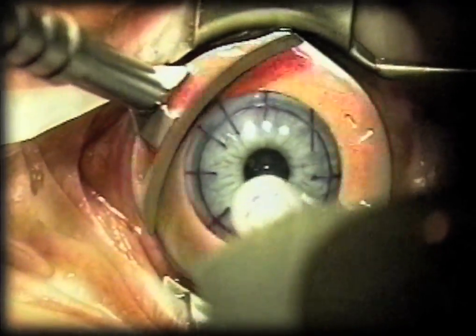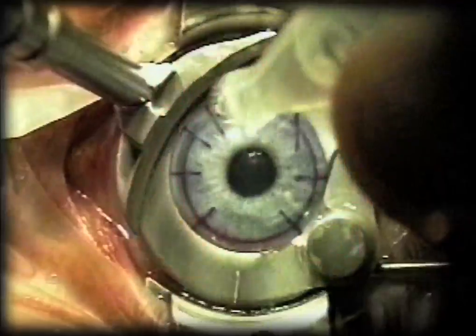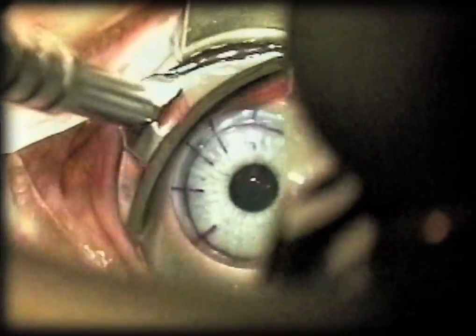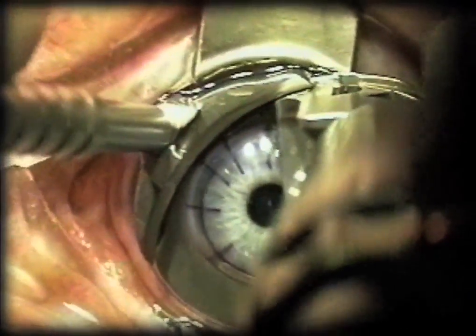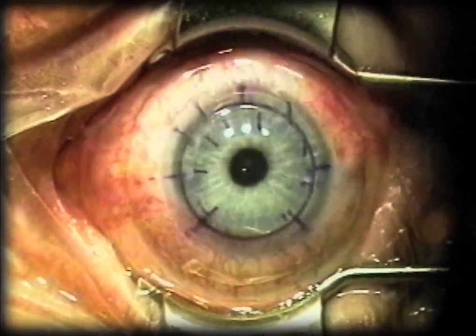My preference is to check the pressure with the pneumotonometer. This is the Moria CB head. You can see how it slips past the cutouts on the blades of the speculum so that you can accomplish the traversing arc. If you have a nasal hinge speculum, this works just as well. The cutouts provide passageways for the microkeratome ring and the microkeratome.